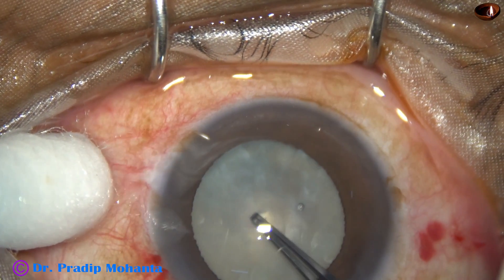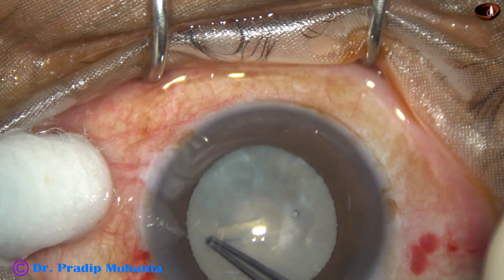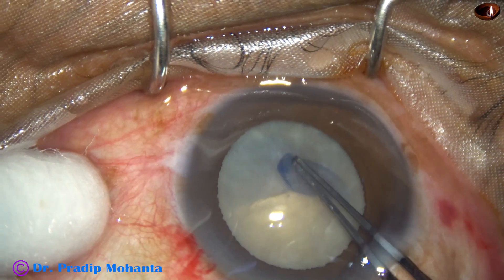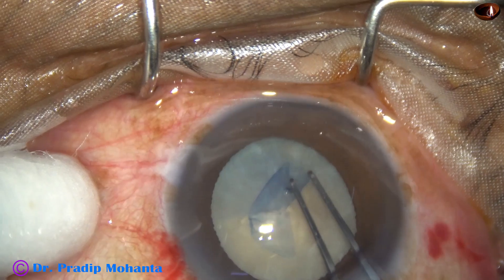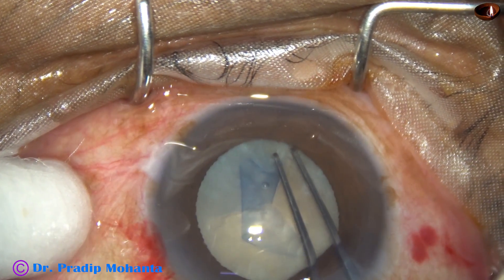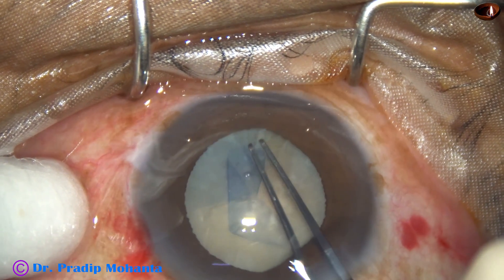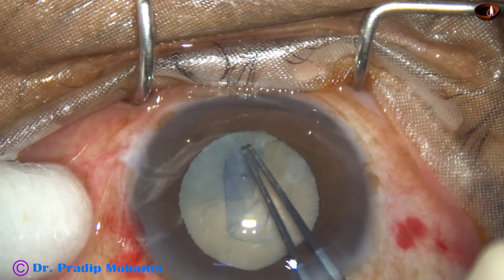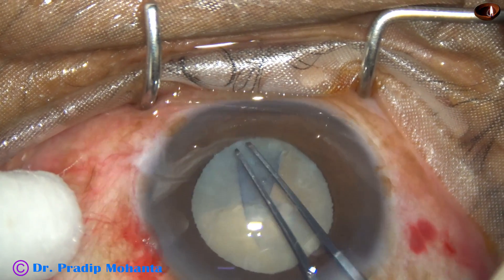I start doing capsulorhexis. The capsulorhexis is fine, but see what happens as I go near 6 o'clock. There is a fibrous band and it takes the rhexis margin under the iris and up to the equator of the capsular bag, and I cannot bring it back.